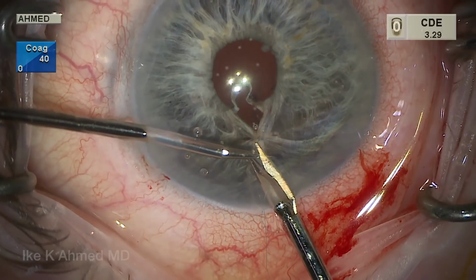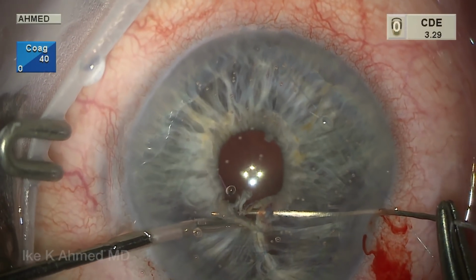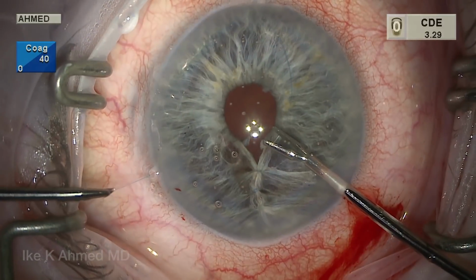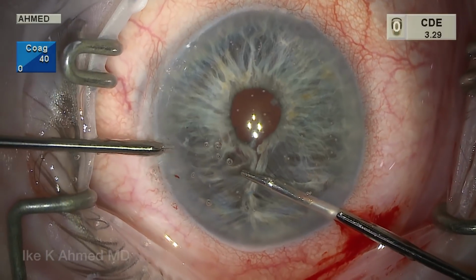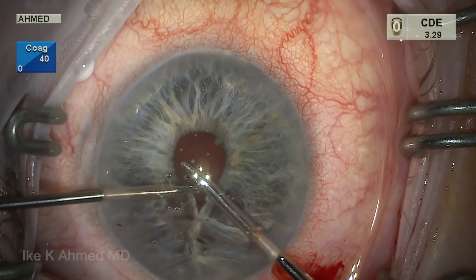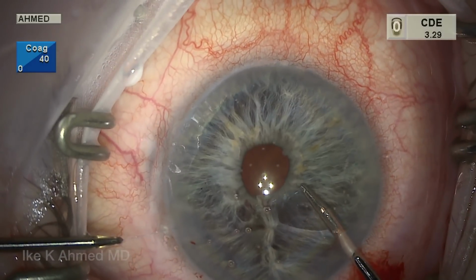We do have to still close the more central defect here, and we're going to pass the needle through the pupillary margin. This does require a little bit of an artistic touch to ensure we have a nice round pupil. And although we thought we could salvage a small remnant of the pupil margin, we're going to release and cut it. And here we're going to show a complete intraocular tying technique, in this case using two micro tiers to do a triple throw into the anterior chamber along the long suture end, grabbing the short end of the suture in the anterior chamber and cinching the knot in place and then locking it in position. Another approach here to suture the defect.